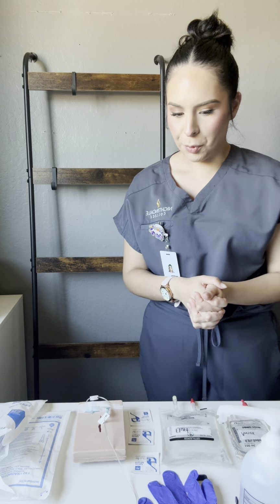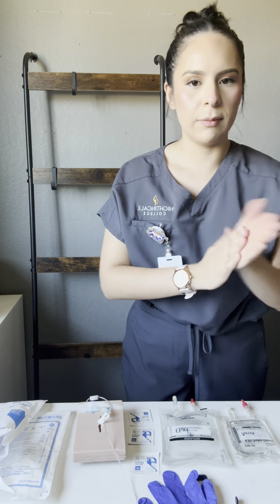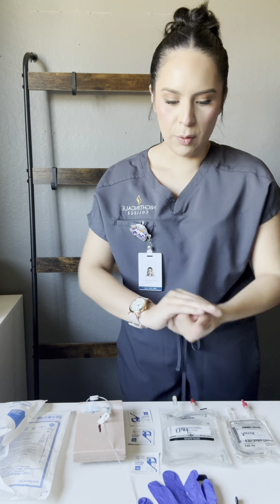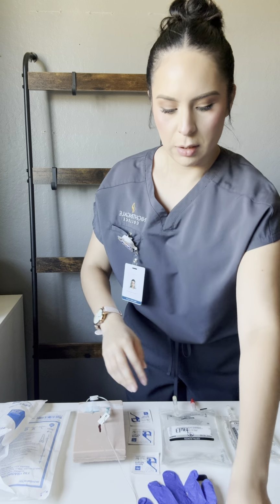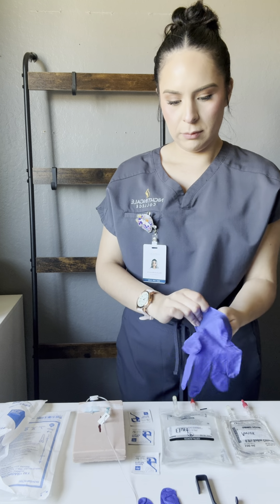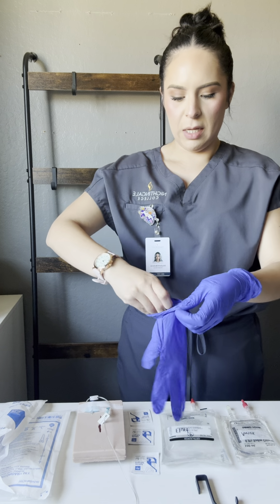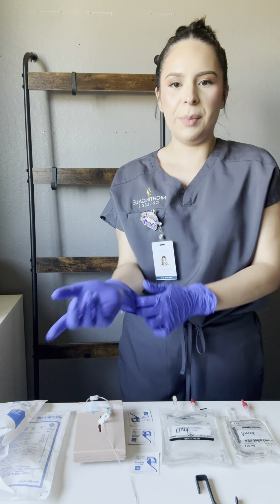The first thing that I'm going to do is perform hand hygiene, and then I'm going to don gloves, and then I'll gather the supplies that I'll be needing.